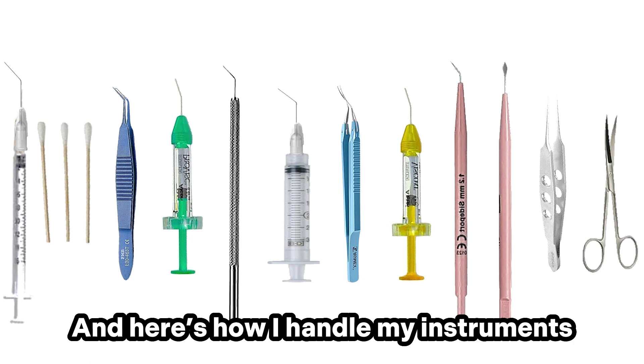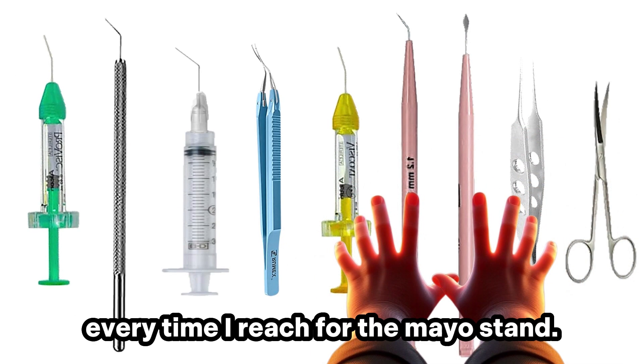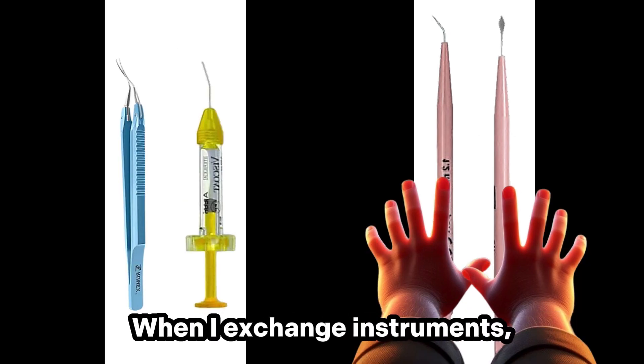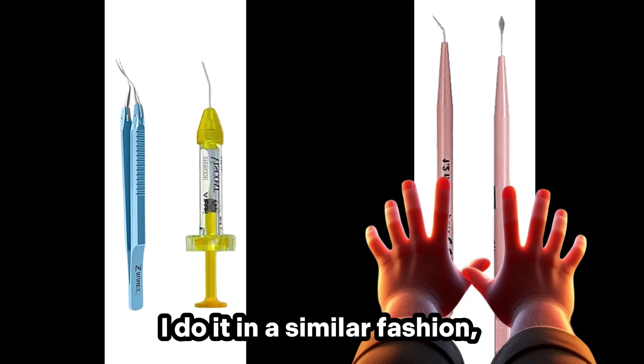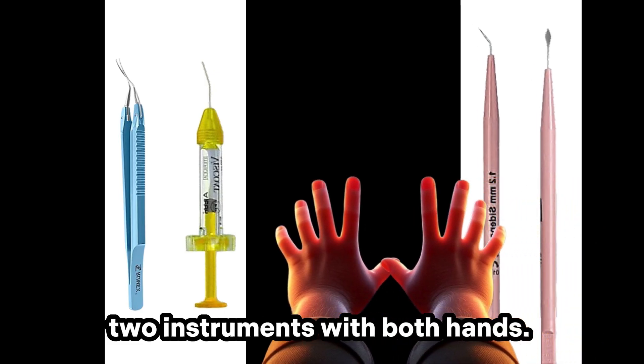Here's how I handle my instruments without a technician. I grab my instruments with both hands every time I reach for the mayo stand. When I exchange instruments, I drop both instruments down and pick up the next two instruments with both hands.